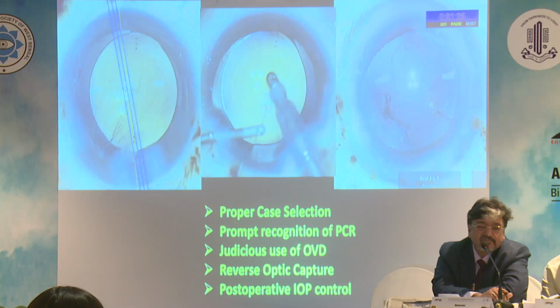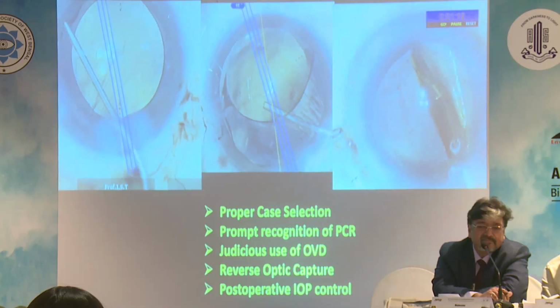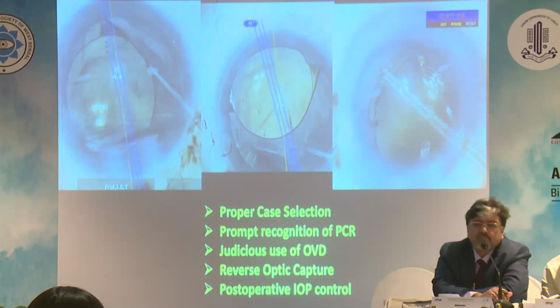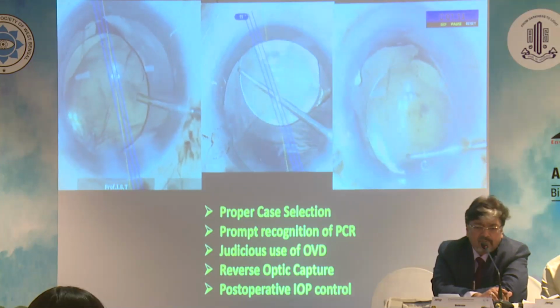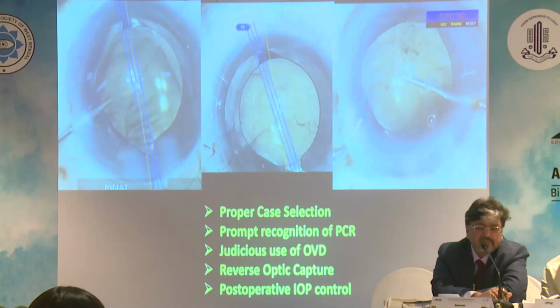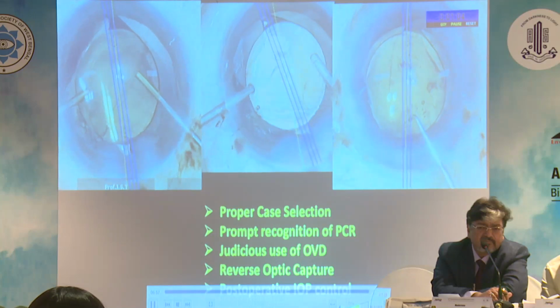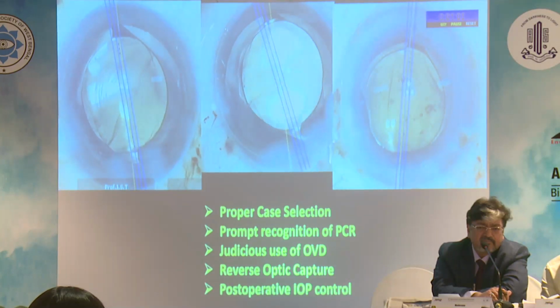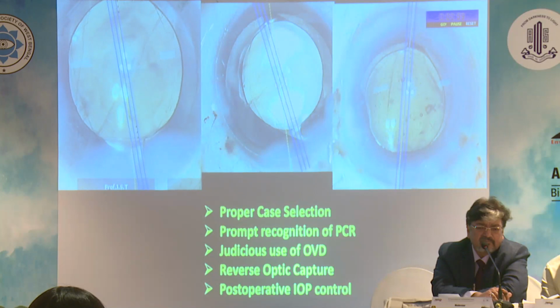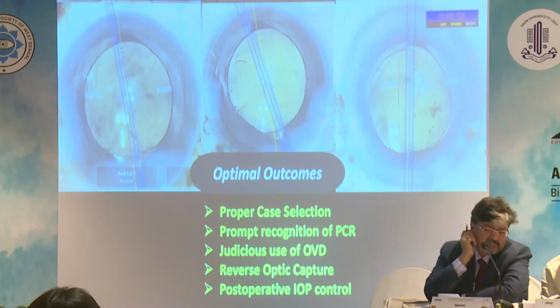Premium IOL implantation can be performed successfully even in the presence of intraoperative posterior capsular rupture. In well-selected cases, reverse optic capture is a useful technique to stabilize a premium IOL. In such cases, post-operative intraocular pressure management is important as complete removal of viscoelastic may not be feasible. Prompt recognition and judicious use of OVD can help us achieve optimal outcomes in patients with PCR planned for a premium IOL implantation.